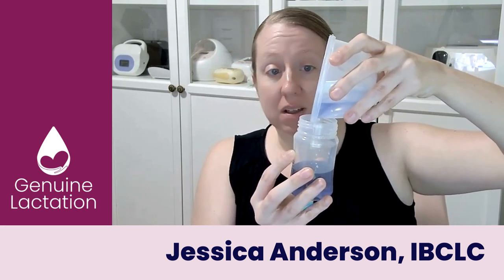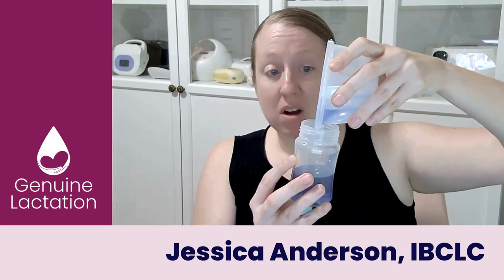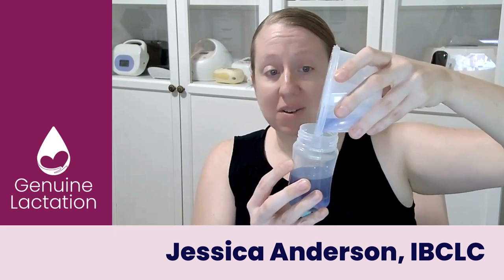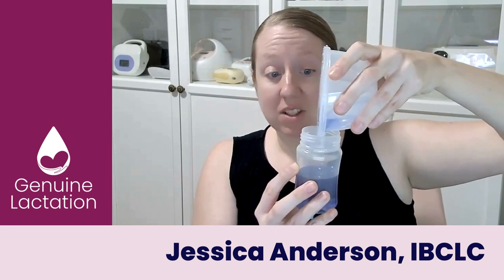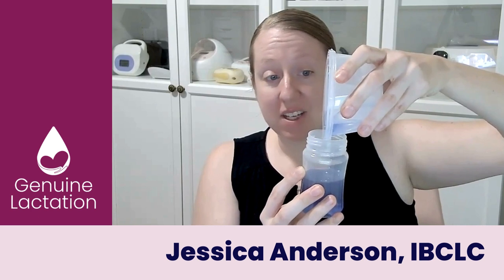So you're just going to go slowly. Some mums are tipping it further forward to try and get it to go a little faster, but when you do that you're losing control of it. So keep it at 90 degrees — just let it pour out. It is going to take just a minute.